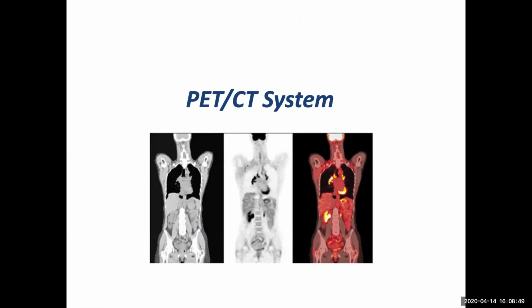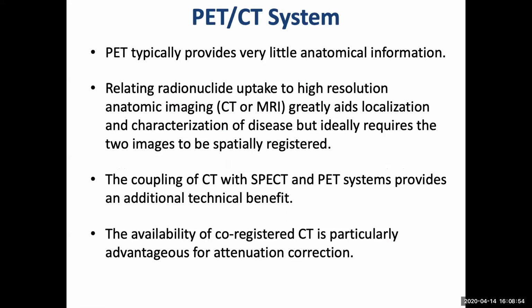Let's go quickly through the hybrid imaging PET and CT system. PET typically provides very little. Sorry, do you have any questions before we proceed?